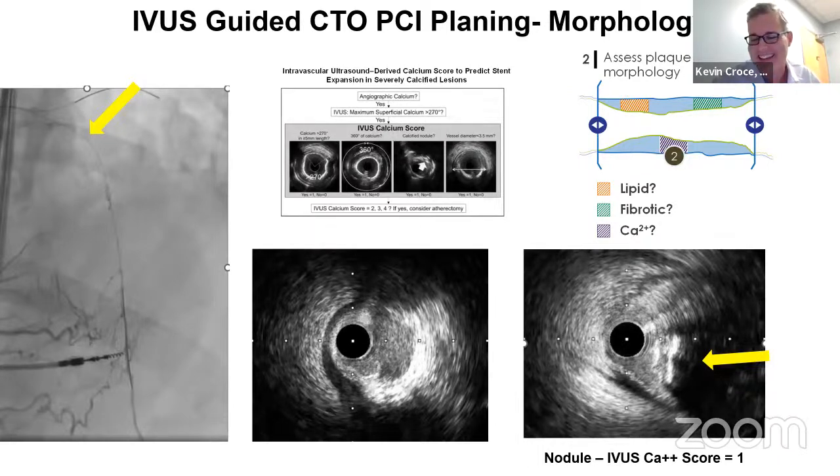I have had very vexing cases, as I'm sure your colleagues have, where we go subintimal and still balloons don't expand in a very nodular-like way. That's irritating, because we're supposed to not face this when we go around these things, but it happens more often than we like. I typically use subintimal shockwave in those cases, and it seems to behave pretty well. I don't know if you have any thoughts about it. Subintimal rota and laser are things I try to pull as little as possible. If we can get it done with IVL, that's my preference.